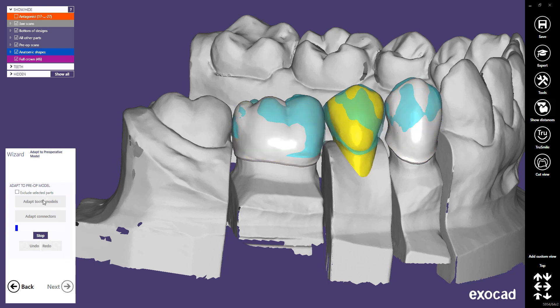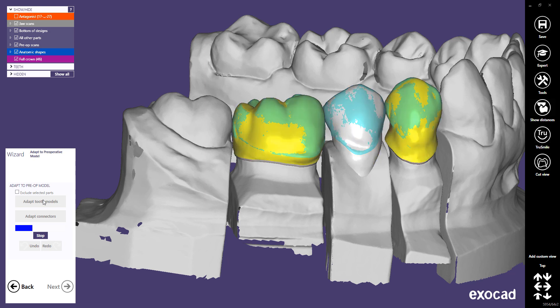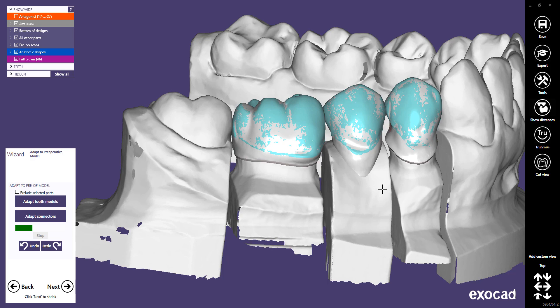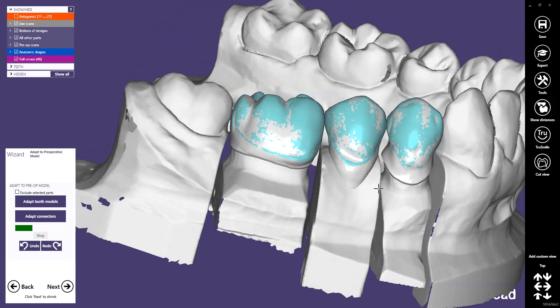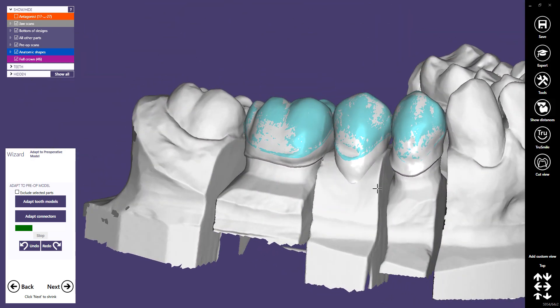Click Adapt Tooth Models to start the adaptation. Model teeth will now be adapted to the scan little by little — you can see the progress. Once you think the adaptation is good enough, click Stop. The following steps are exactly the same as for an anatomic or reduced restoration.